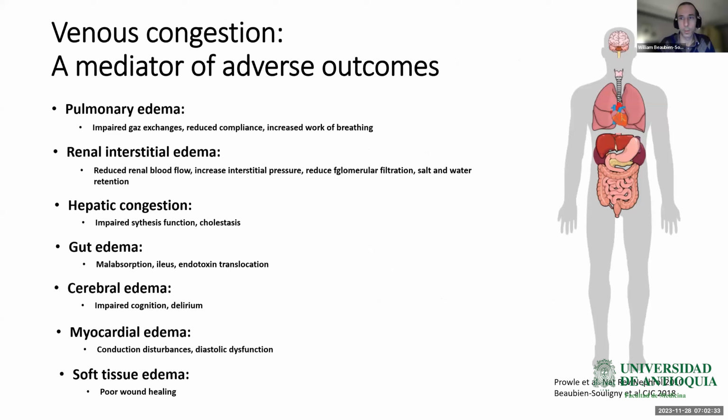Now, when venous congestion develops, there are two phenomena that can be seen. First, the venous return during systole is decreased because the right atrium is dilated and at high pressure. So when the tricuspid valve closes, there is not this atrial filling that we see in the normal situation. So the systolic component of venous return is decreased.